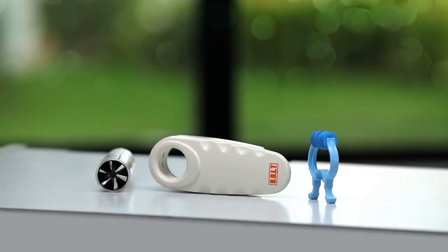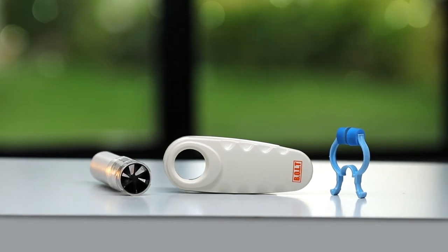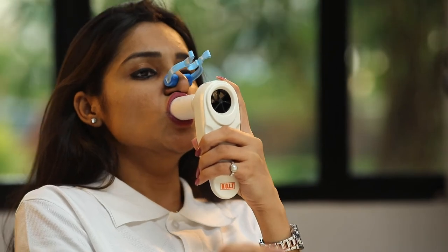The Bolt spirometer is a compact and portable wireless device that assesses your lung condition in just a blow away. To assess your lung condition, simply fix the turbine to the spirometer. Now, exhale completely into the spirometer mouthpiece and then inhale to the maximum.